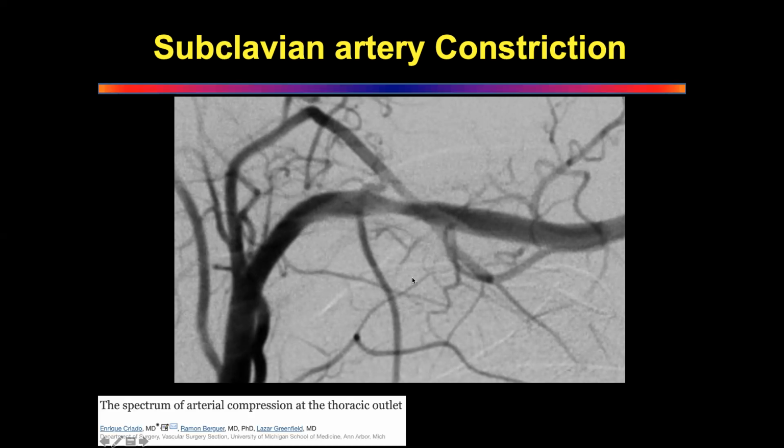So first you take a picture without dye, and then you infuse the dye, and then again take a picture, and then on a monitor you subtract the image obtained before from the image obtained after. Good. So you actually subtract digitally, it's not a technique that is physically done. It is a computer manipulation.